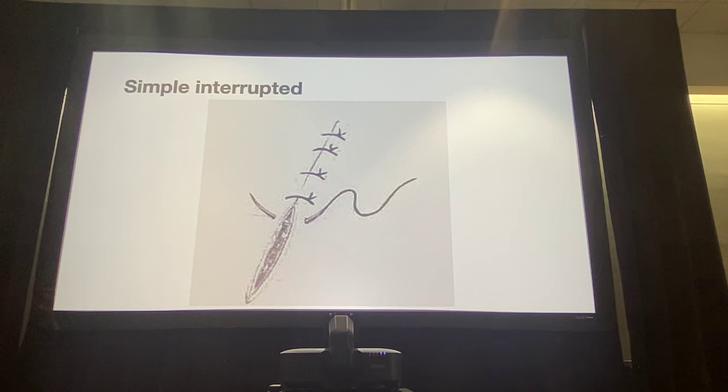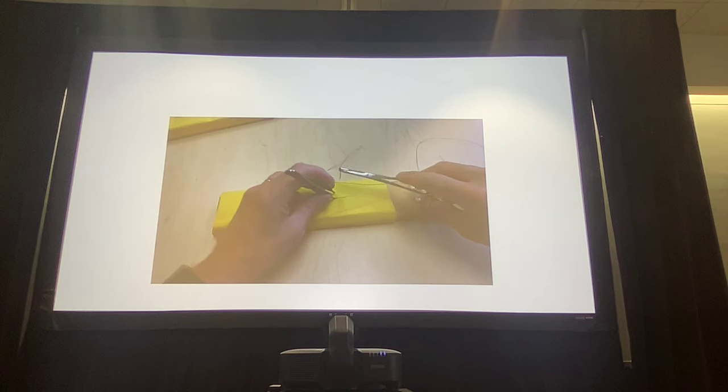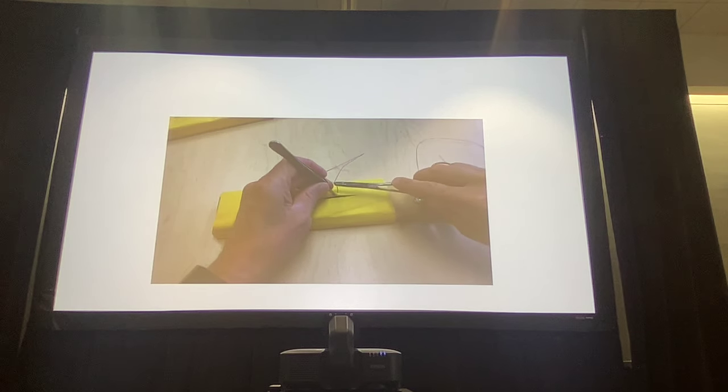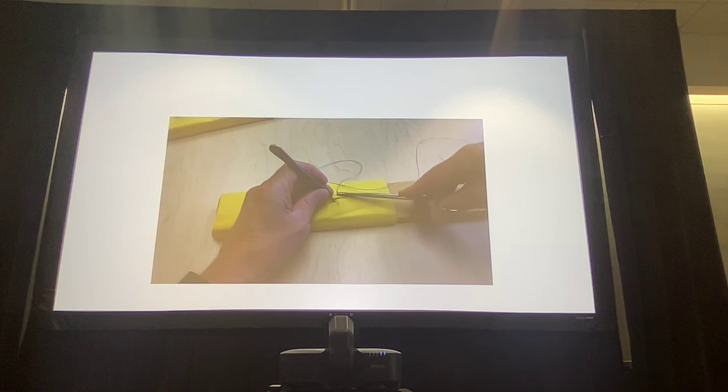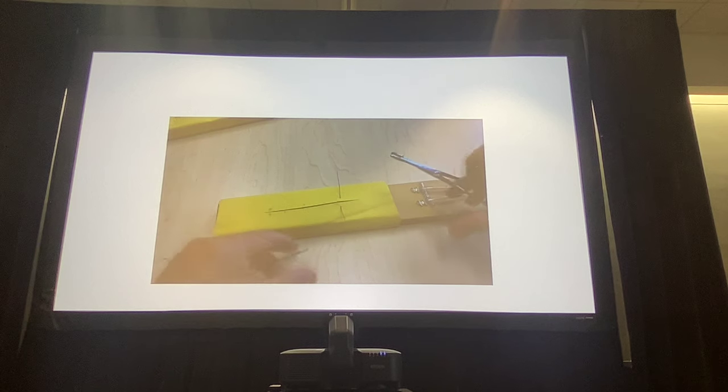So a lot of you have already been doing this anyway through practicing these knots, but I just wanted to let you be aware of, you can actually close the entire incision by placing these knots side by side. And when you're going through vet school and you're learning for the first time, most clinicians, professors, will only let their students do interrupted and not continuous, because if one suture fails, at least you have the other sutures to hopefully keep that incision together.